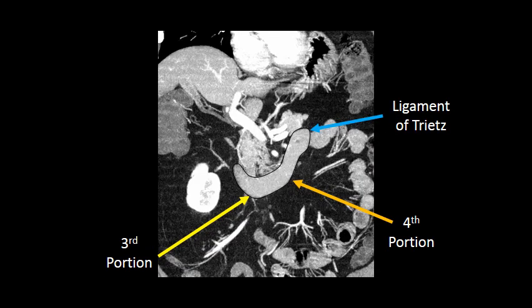The third portion of the duodenum sweeps under the superior mesenteric artery, and then the fourth portion re-enters the peritoneal cavity. The ligament of Treitz is not readily identifiable on CT, but the bend from the fourth portion of the duodenum into the proximal jejunum roughly demarcates the ligament of Treitz, indicated by this blue arrow.